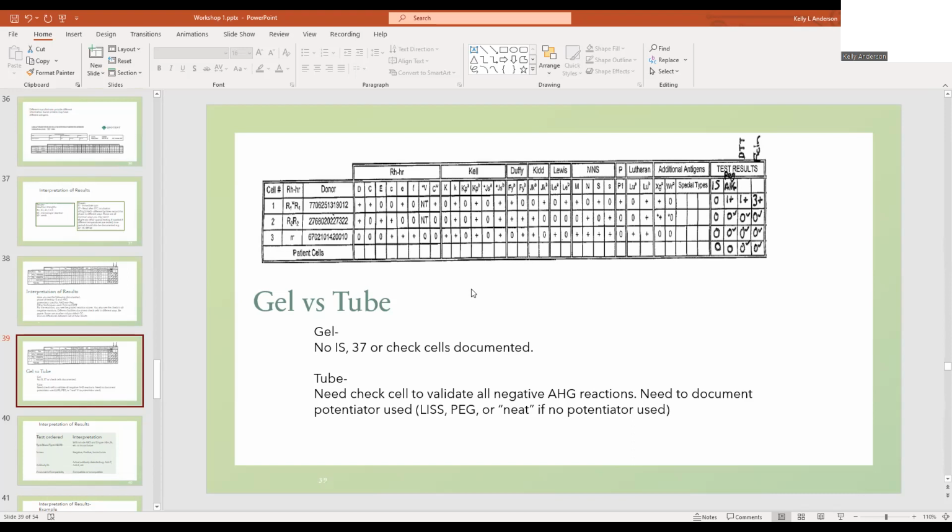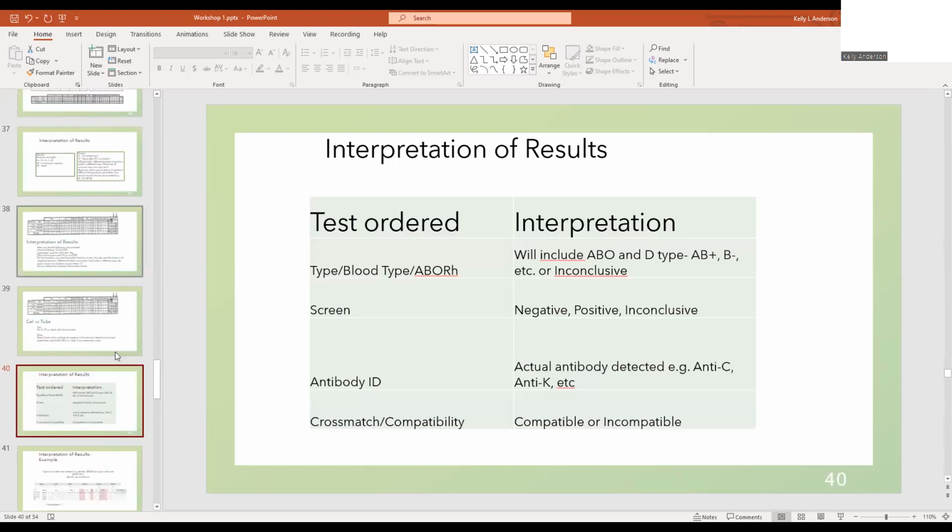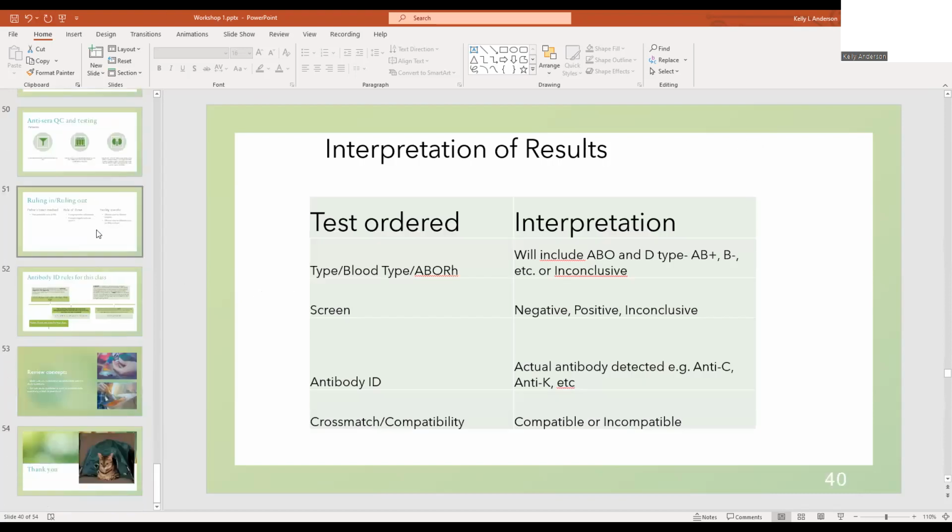Okay, everyone see the ABO card? Yeah. What is it? Okay, and is there an ABO discrepancy? No, okay. What is an ABO discrepancy? I also have an ABO discrepancy lecture. If you'd like to go over it, then you can stay and go over it, or you can leave. I'll leave it up to you guys. Okay.